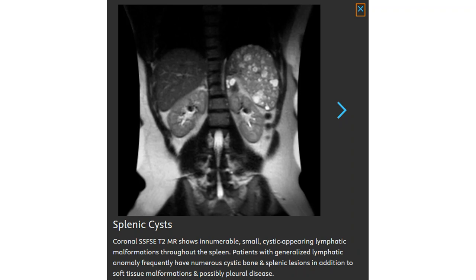This is an SSFSE T2 image showing a number of small cystic lymphatic malformations throughout the spleen. Patients with generalized lymphatic anomaly frequently have numerous cystic bone and splenic lesions, in addition to soft tissue malformation and possibly pleural disease.